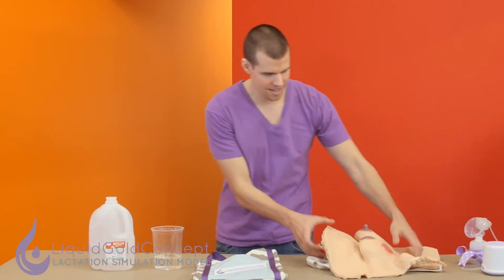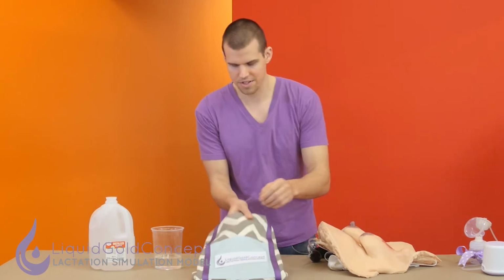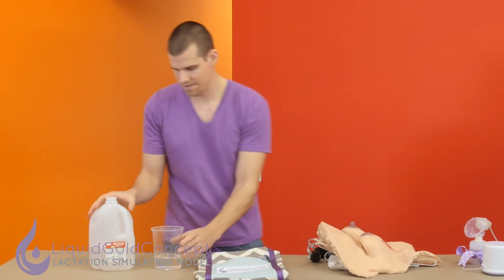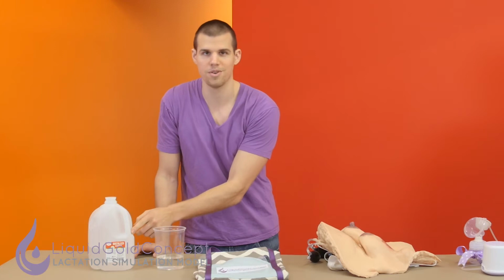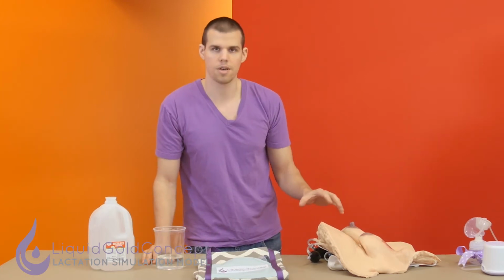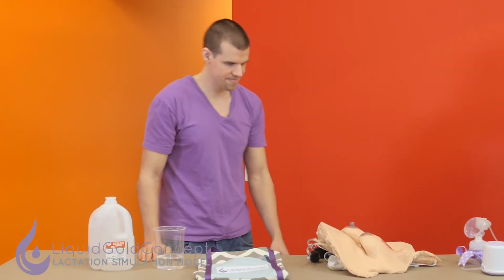So in front of me, I have my LSM. I have the tote bag it came with, along with the syringe, and I have some distilled water that I'll use to fill the lactation simulation model. It's very important that we only use distilled water because we don't want any of the internal components to clog up over time. So to help me fill it, I'll ask Anna to come over.